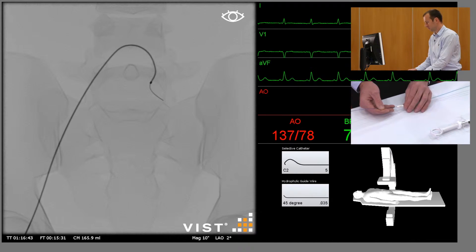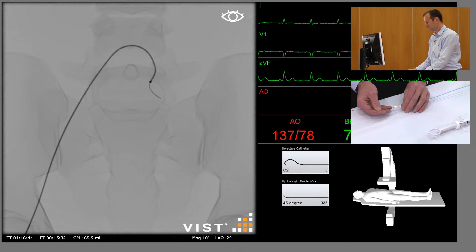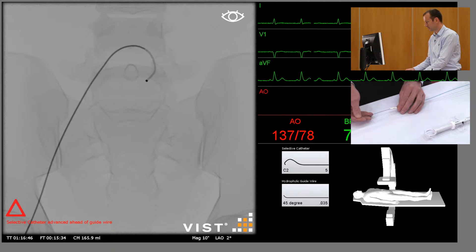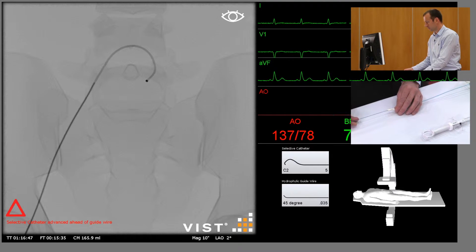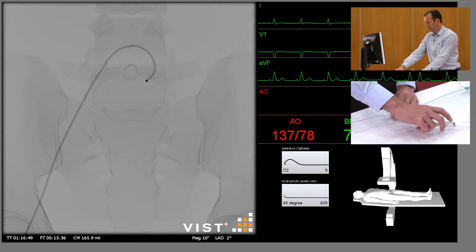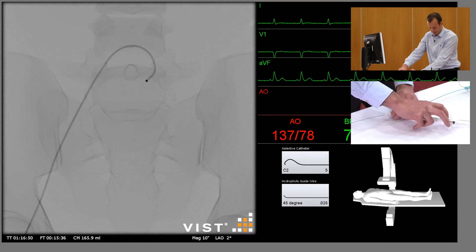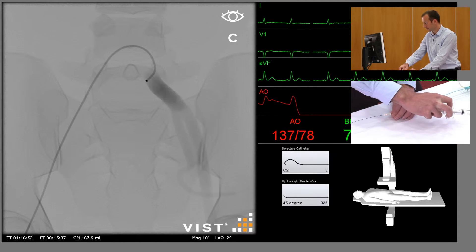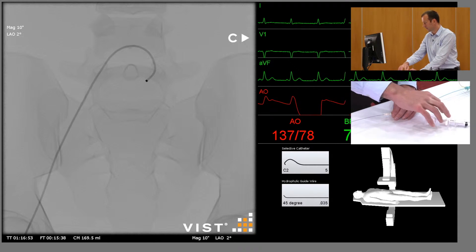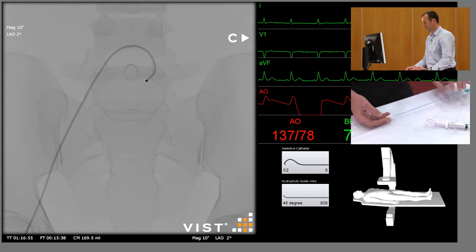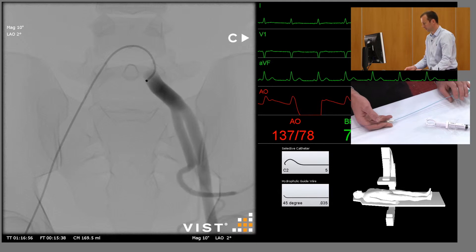Withdraw the guide wire, do an angiogram, and identify the bifurcation of the internal and external iliac arteries.